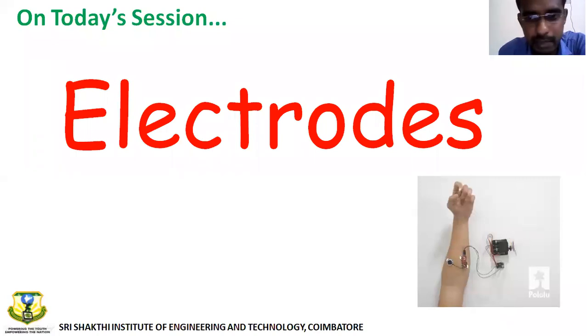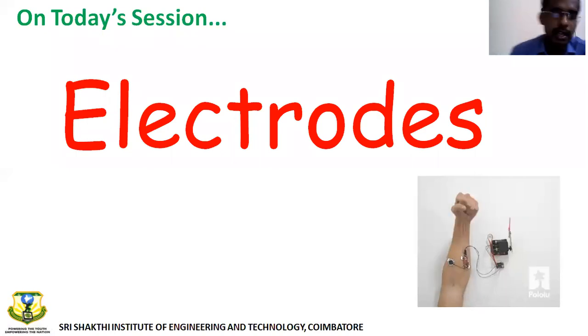We'll see the types. That could be an arm or some development board, whatever, right? It could be an Arduino or a Raspberry Pi Zero. It seems like a Raspberry Pi Zero. It could be anything, and then it does the thing. So it is picking the signal. What is used to pick the signal from the body is what we call electrodes.